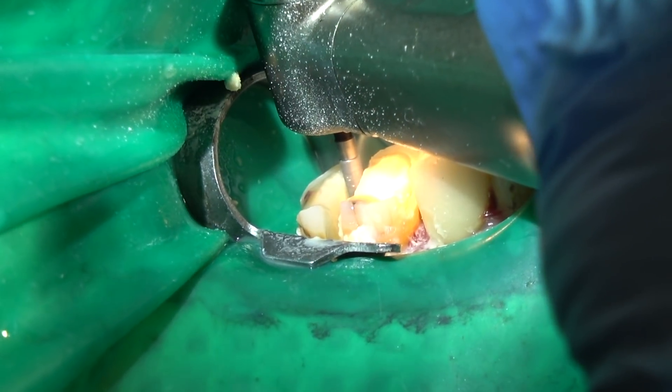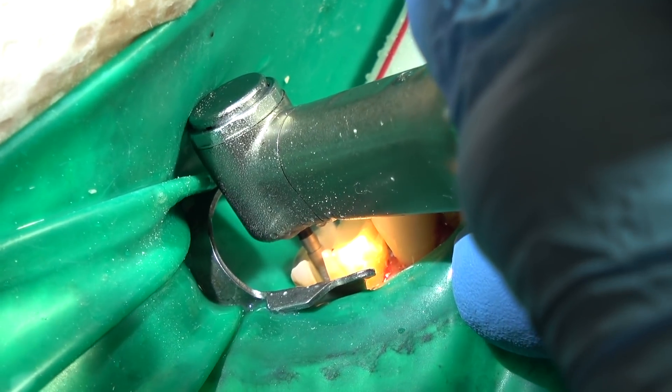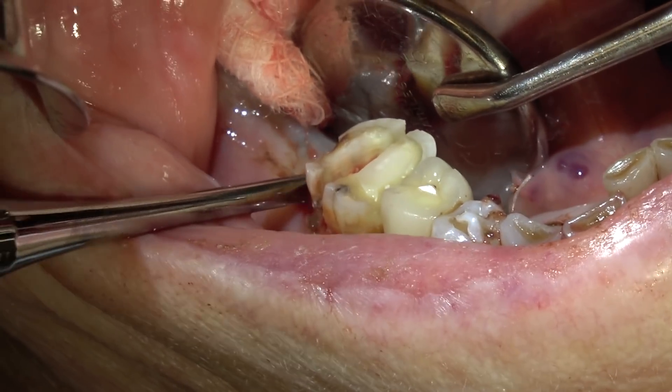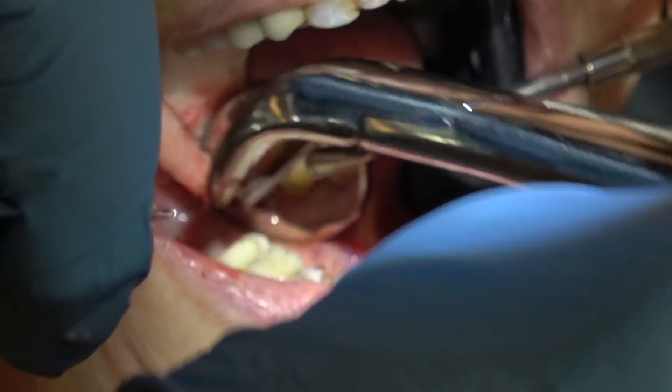This is just a coarse barrel diamond. Lots of water, light touch. Be sure you cut all the way through the furcation. I like to use a rubber dam for this. Just elevating that root — now it's probably going to break off. The coronal half is probably going to fracture because of all the decay, and we'll have to go back and remove it.